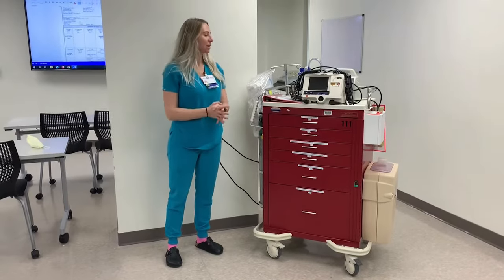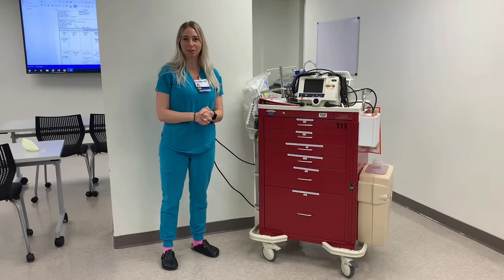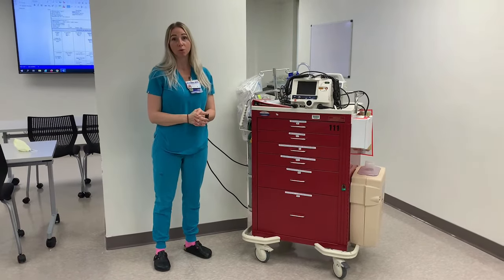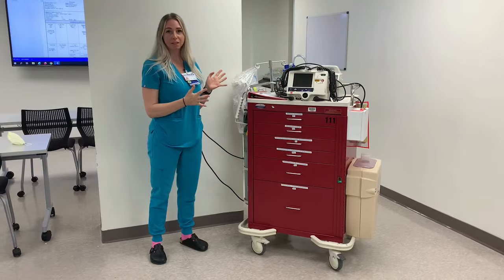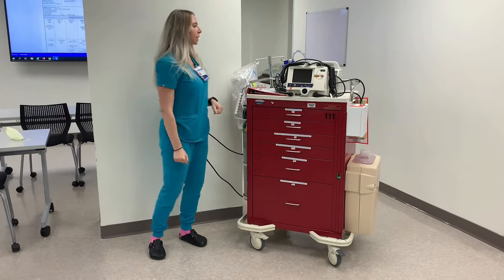Hi everyone, this is Shannon. I'm one of the educators in the ICU department here at Baylor St. Luke's and today we're going to do a video series on the code cart. The first video here we're just going to walk you through everything that is on the front, back, and sides of the code cart so that you can understand the different components that make it up.